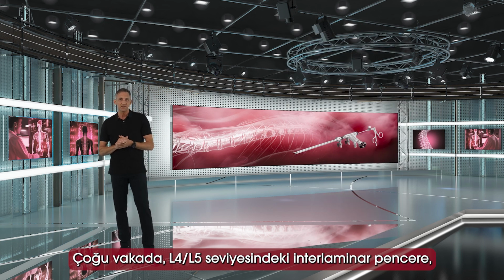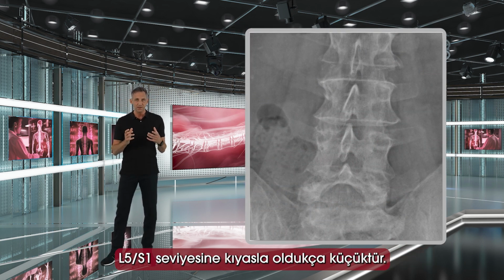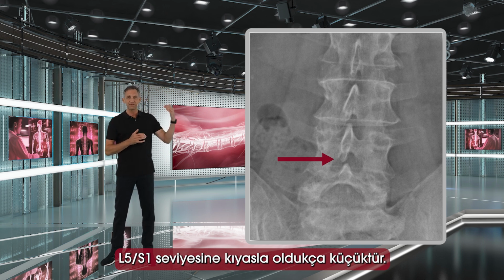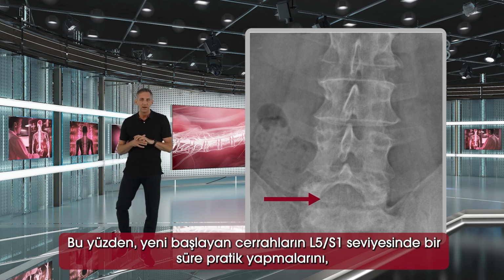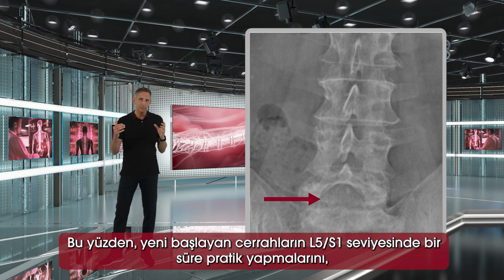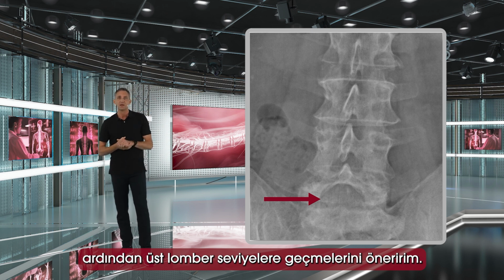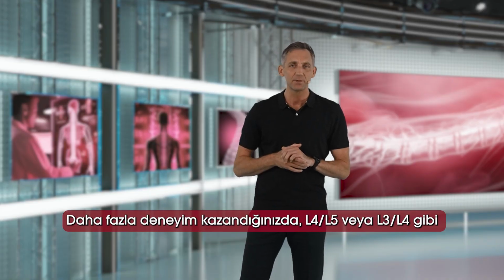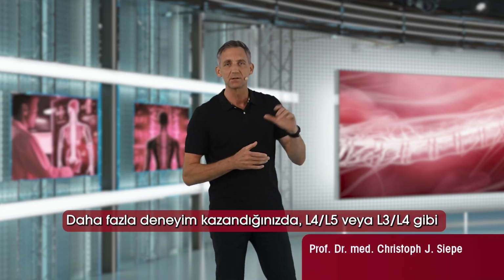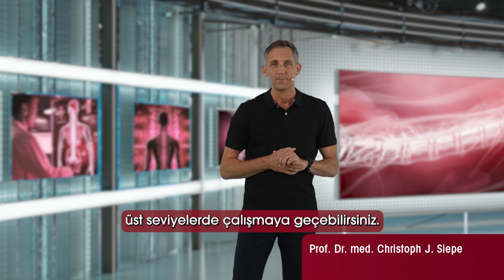In the majority of cases, the interlaminar window is already significantly smaller at the level L4-5 in comparison to the level L5S1. Therefore, for beginners, I really recommend stay with L5S1 for a while before you continue going up to upper levels of the lumbar spine. Later on, when you feel more comfortable and when you feel more experienced, then you can still go to the upper levels L4-5 or L3-4.